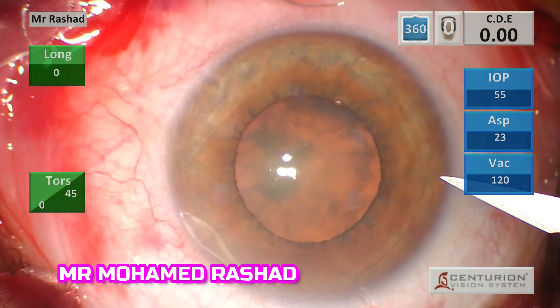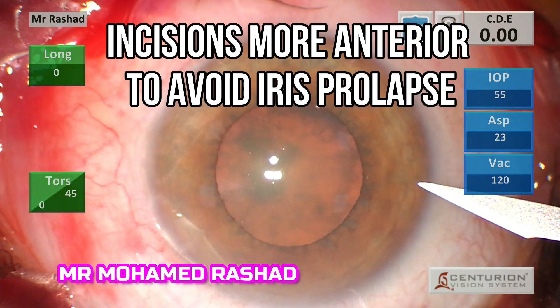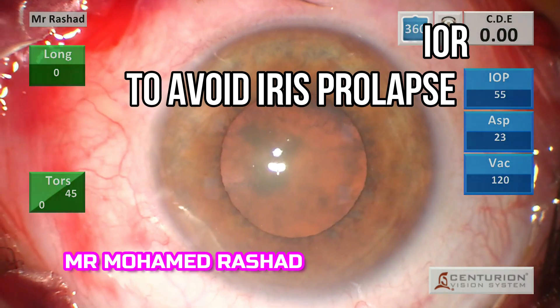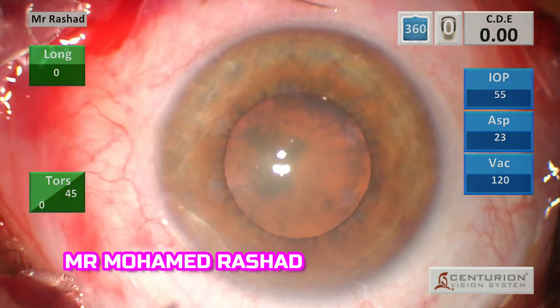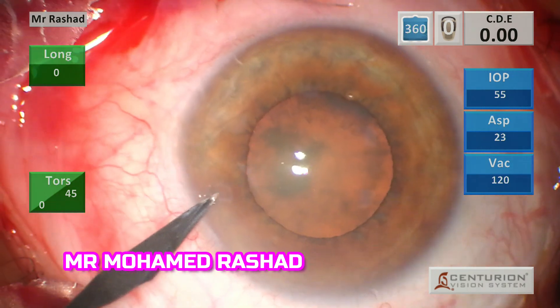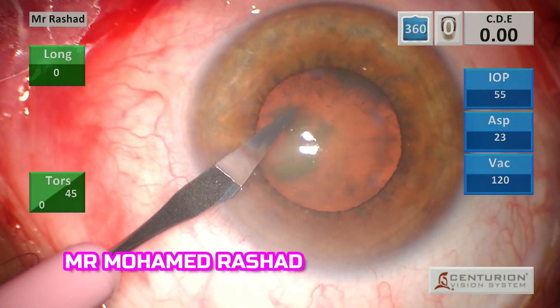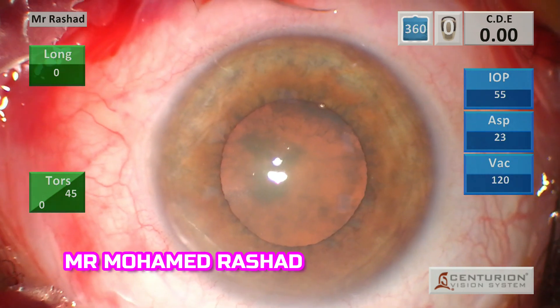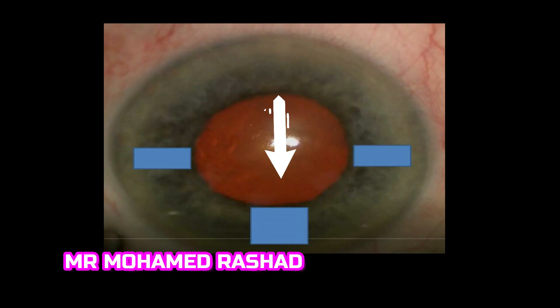I usually do paracentesis more anteriorly in these cases to avoid iris prolapse. I usually go at 9 o'clock and about 2 o'clock, parallel to the iris plane.